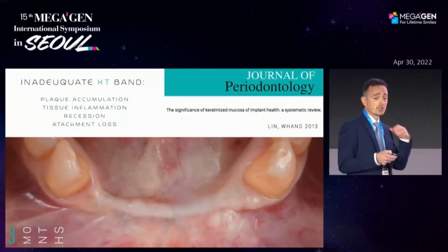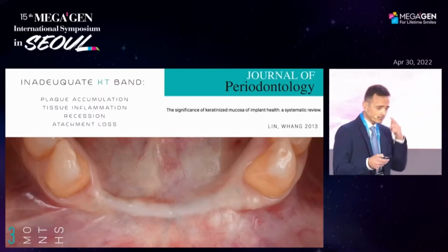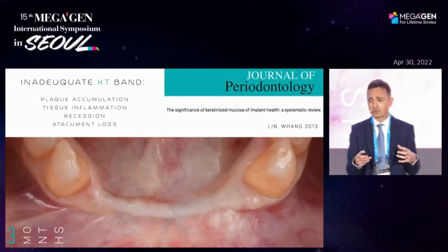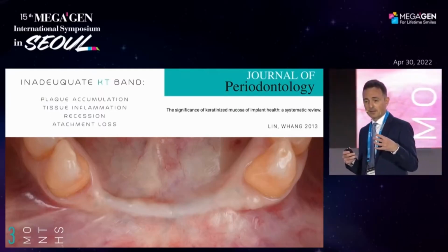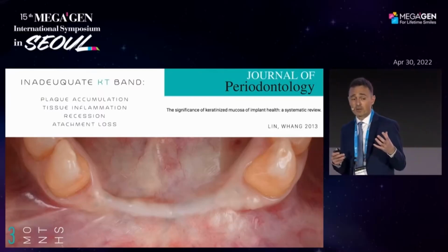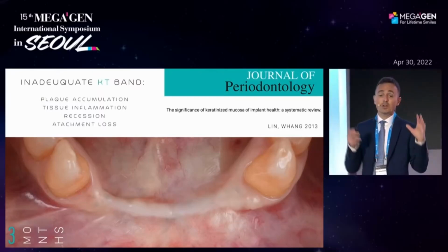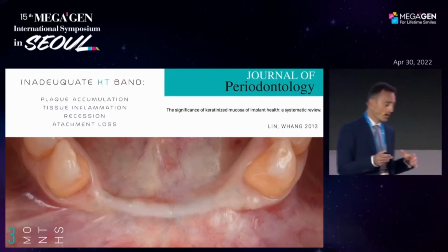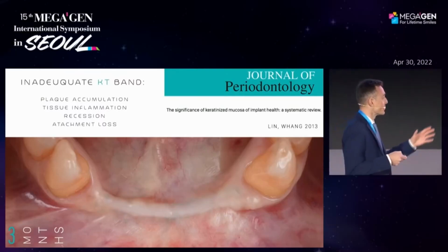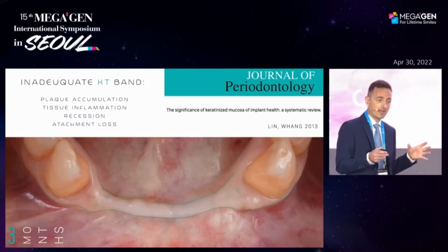So about the soft tissue, after 3 or 4 months of implant healing, we are sure about the osseointegration. We check everything using X-ray exam, but the most important thing that I would like to share with you is that today we don't have to look just at the bone, but we also have to consider the soft tissues. And what I can see in this picture is that the soft tissue is not enough to protect my implant in the long term.